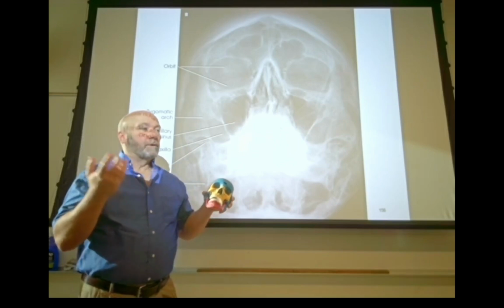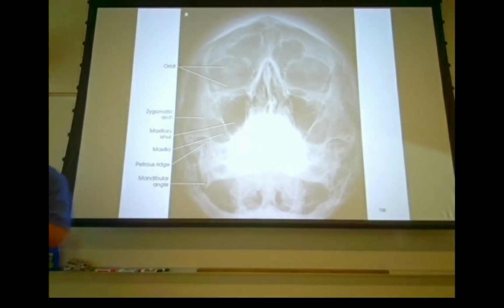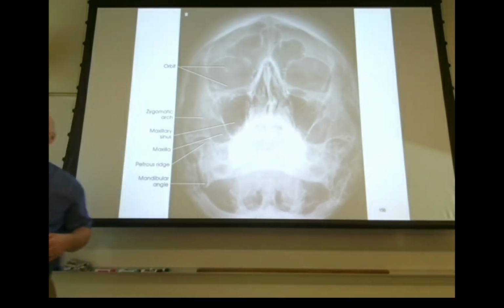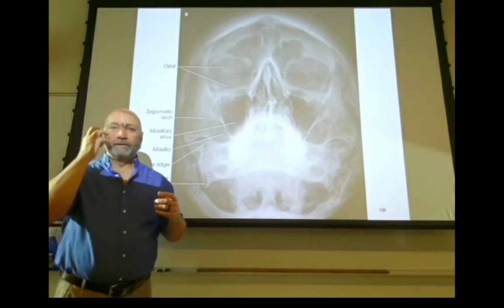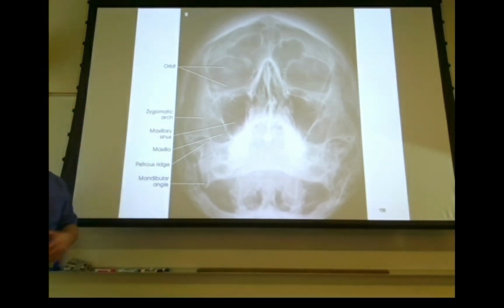Okay, so again, zygomatic bone fracture could be referring to that. Or not a zygomatic bone fracture, but orbital bone fracture could be referring to a tripod fracture. Tripod fracture, you've got connection here, here, and here. All three points of articulation are gone. It's broken. Okay, so you can see everything. You can see the entire skull with the exception of possibly your basilar skull fracture. You can see it on the Waters.